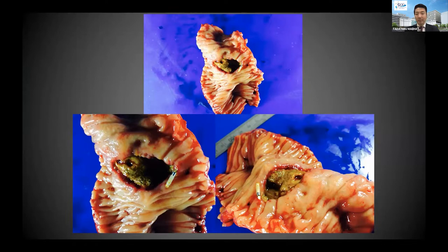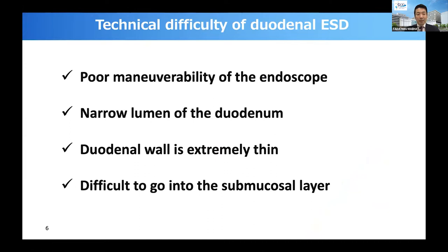There are several reasons for the technical difficulty of duodenal ESD. The duodenum is far from the mouth with a narrow lumen, which often limits the maneuverability of the endoscope and sometimes makes it difficult to even approach the region. Moreover, the duodenal wall is extremely thin and perforation can easily occur.